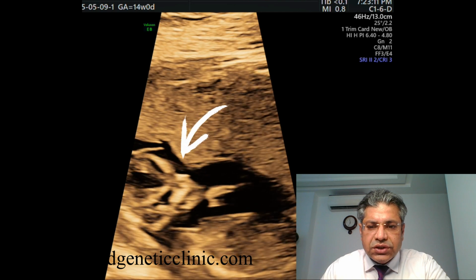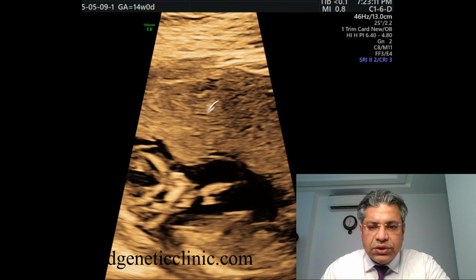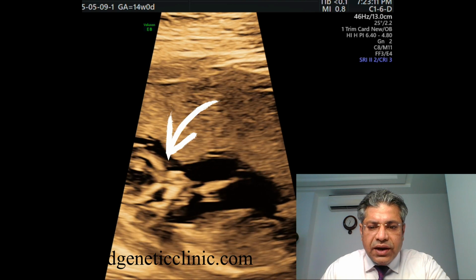What we saw is that we could not get the equal sign, and the bone that we are getting is the nasal skin and the malar bone. Aneuploidies, specifically trisomy 21, are very common. Out of 700 live-born babies, one baby can have trisomy 21 or be a Down syndrome baby. They are as common as that. But if we talk about the antenatal period, the frequency is around 1 in 300. So that is very huge.